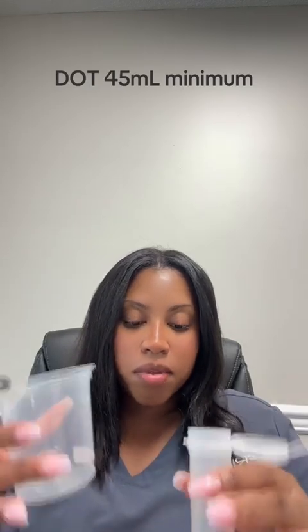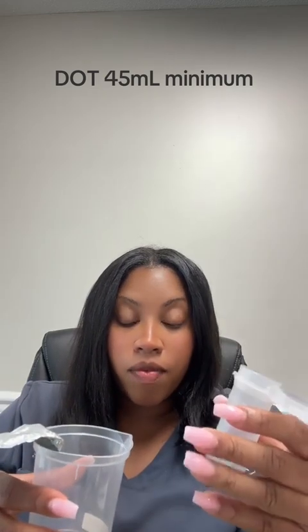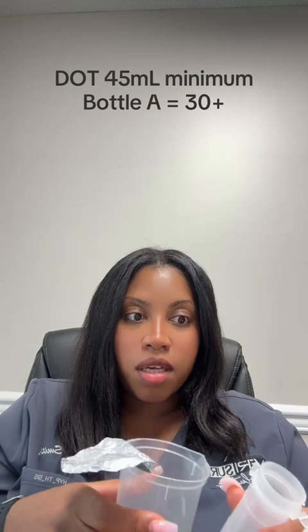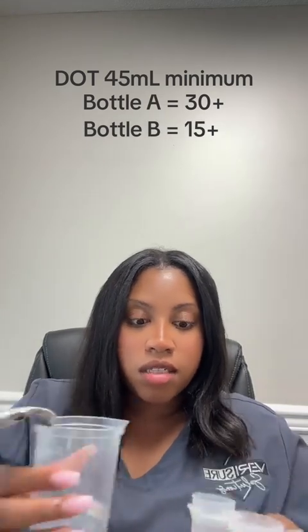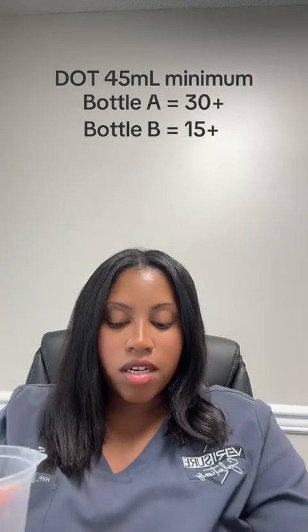This will have urine inside, and then you're going to take that larger cup and pour it into the specimen cup. Per DOT, you have to have 45 milliliters, but I like to do a little bit more. So I suggest that they do above 45 milliliters so that when you pour it into the split, one is going to be 30, one is going to be 15, but add a little more than 30, and a little more than 15 in case anything happens. So you're going to pour it inside a little above 30, and then pour the next one a little above 15.